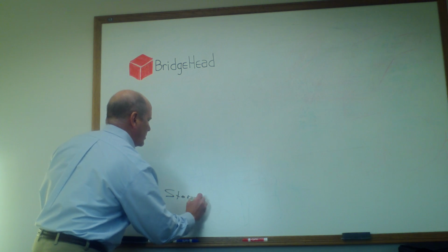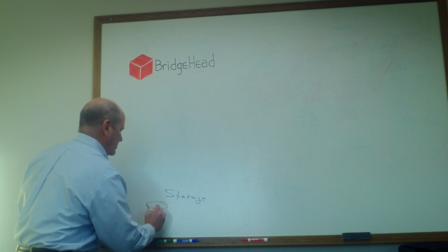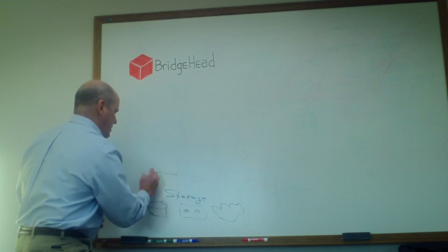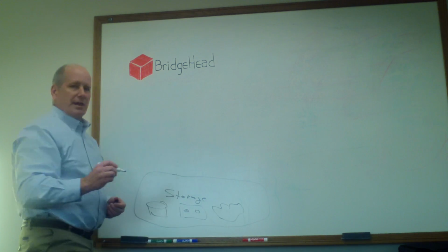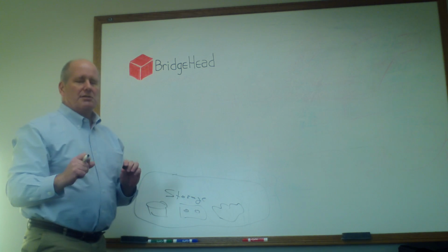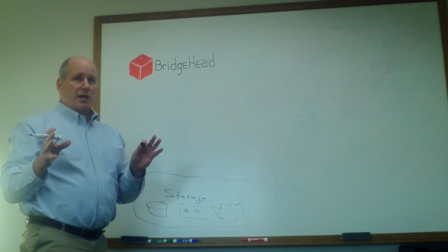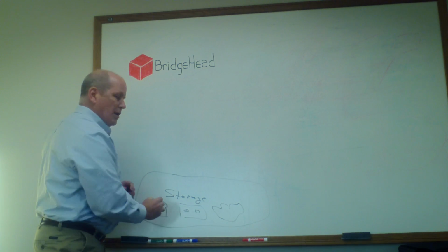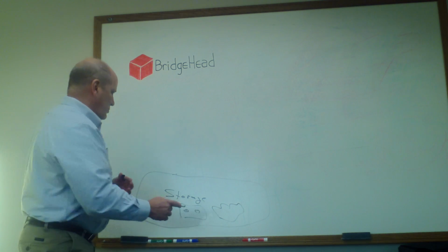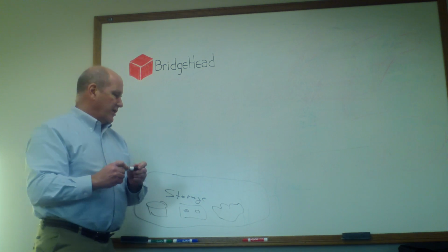Obviously, you need the ability to store the data in some physical platform, whether that's disk, tape, or even cloud. You need a storage layer to actually store that. The problem is that storage technology changes over time. If you're going to archive data for 30 years, you're guaranteed that what you initially write it on will not be the same as what you might need to restore it on 30 years from now. So storage technology changes, and you need the ability to support multiple storage devices.